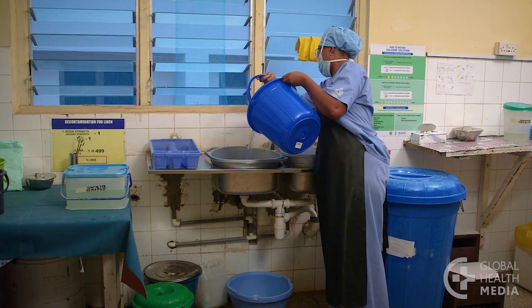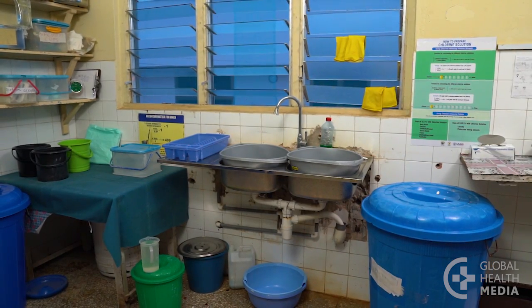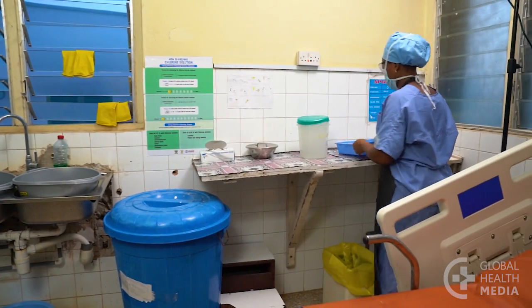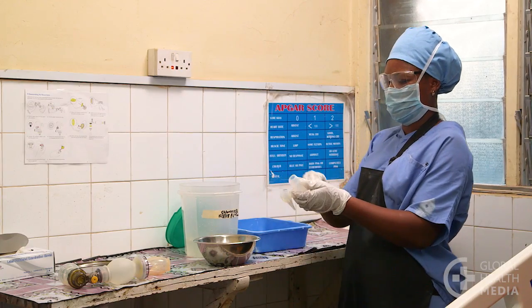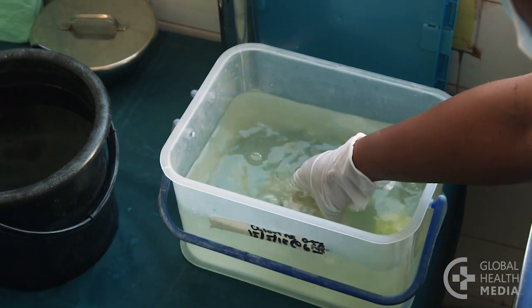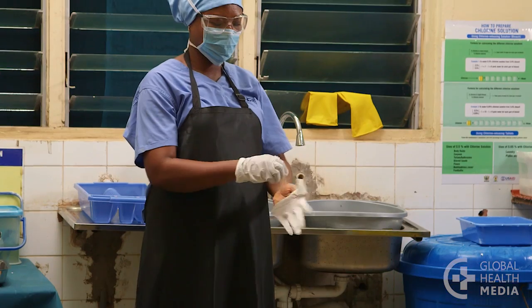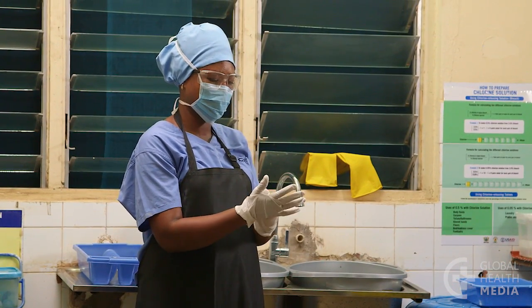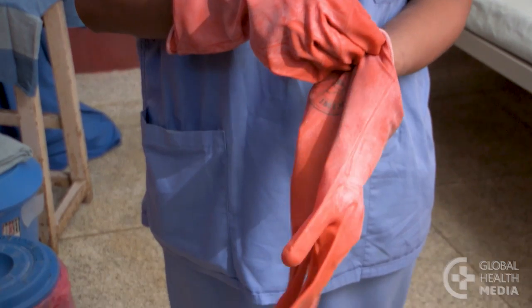The first step is preparation. Organize the room into a separate clean area and a dirty area. Wear protective clothing to protect yourself from harmful germs on the equipment and any splashes of chemical. You need boots, an apron, gloves, mask, eye protection, and a cap. You can wear clean exam gloves or utility gloves at this step.